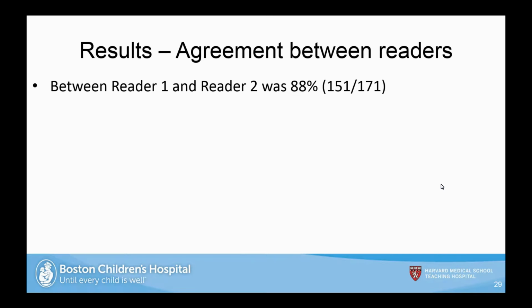And that wasn't clear in the paper, what the criteria was for labeling it. It just sounded like they had two radiologists come in, go through all these cases, and say, okay, this one's diagnostic, this one's non-diagnostic. But they didn't really specify why. And when they got the results back, I don't know if they went back to the radiologists and asked them, why do you think the algorithm spit out non-diagnostic versus why you said this is diagnostic.